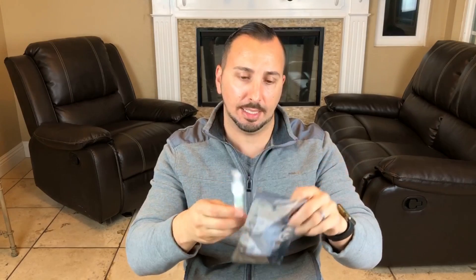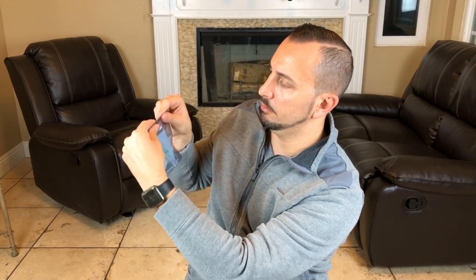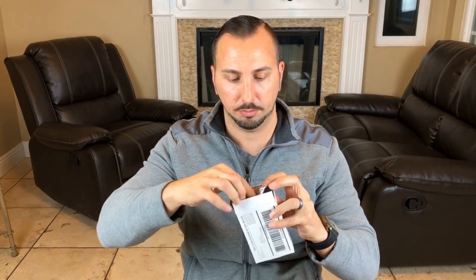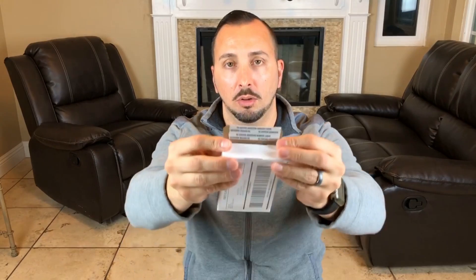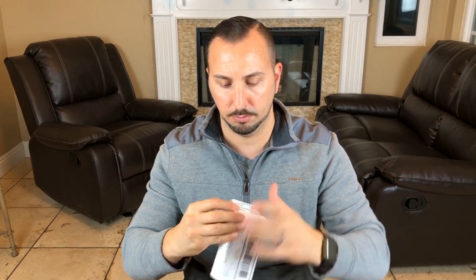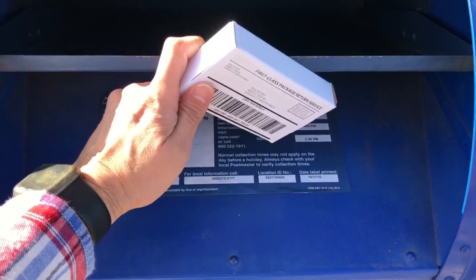Now we're going to place the tube in the collection bag and seal it off like so. We're going to take our sample and place it in the box. We have some adhesive tape here and we're just going to seal the box. It says no postage necessary if mailed inside the United States, so we don't have to put any stamps or pay for it — we're just going to put it in a mailbox and it's going to be good to go.